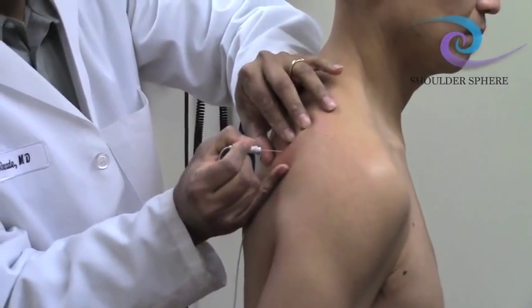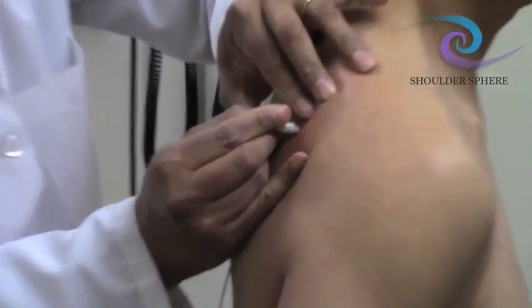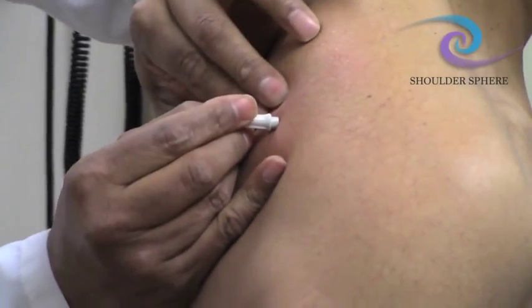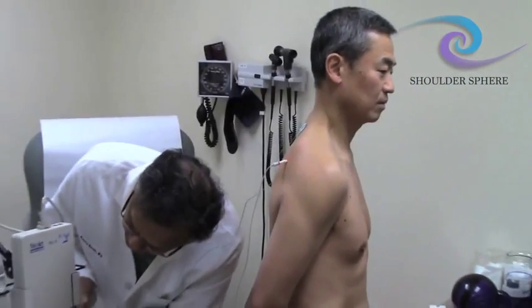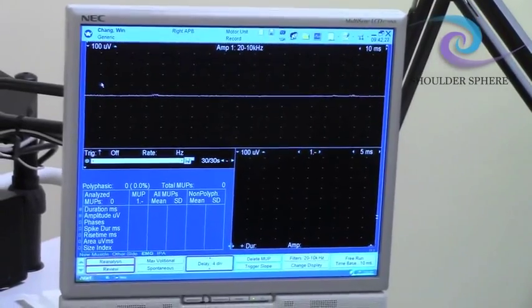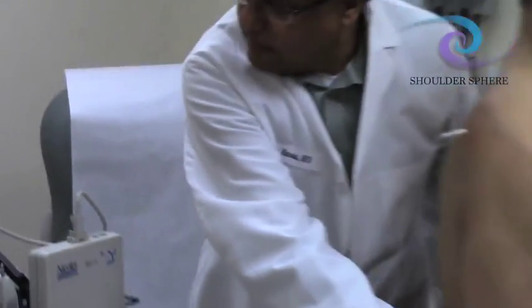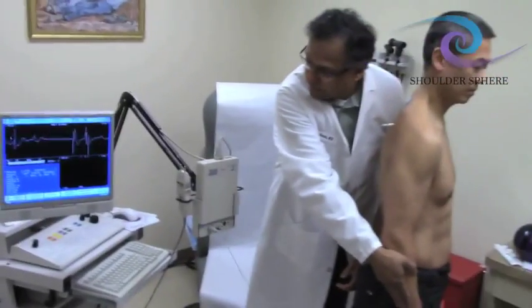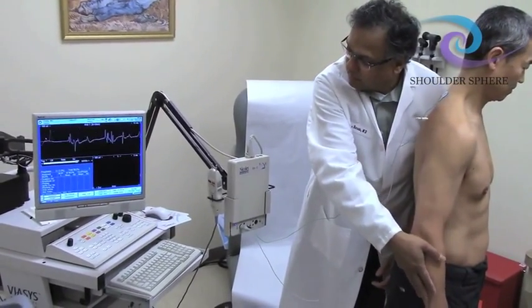We locate the spine of the scapula and go right below it — it's a thick muscle, you have to go through the trapezius. Now we're in the infraspinatus, and how do we know? We check the activity. You can see at rest the screen is flat because there are no nerves sending messages to the muscle fibers to make them move. Then we recruit the muscle — you can abduct, and you can see it starts firing. Now at rest, the screen returns flat.